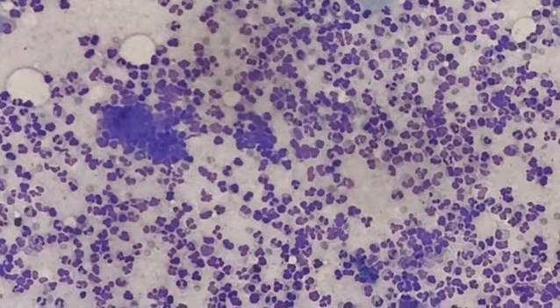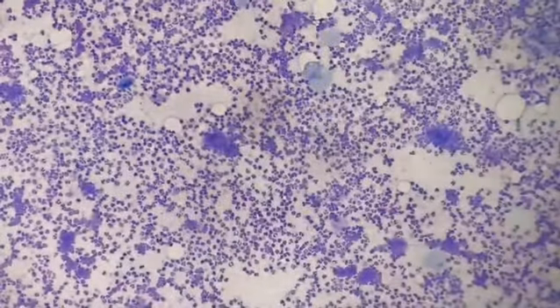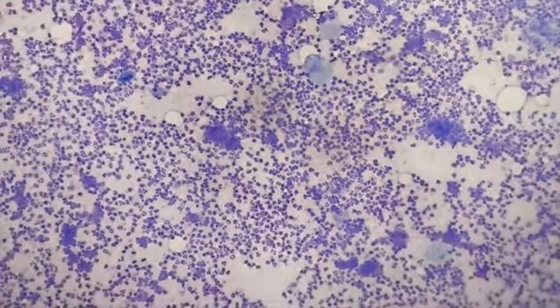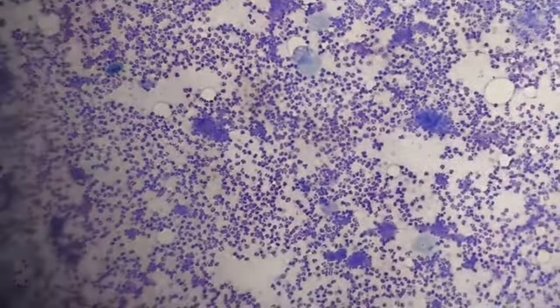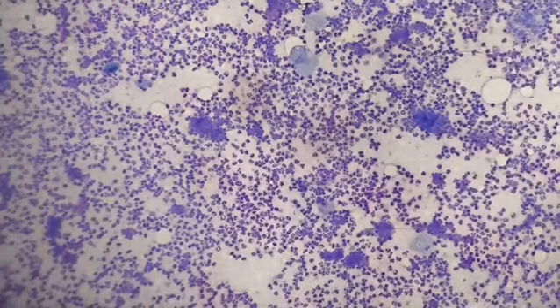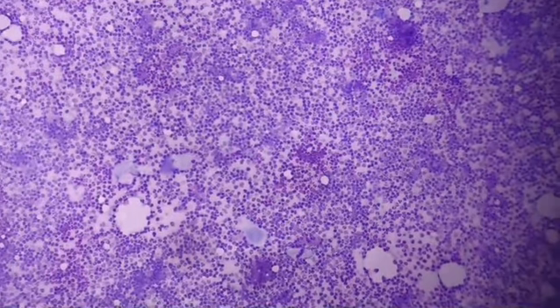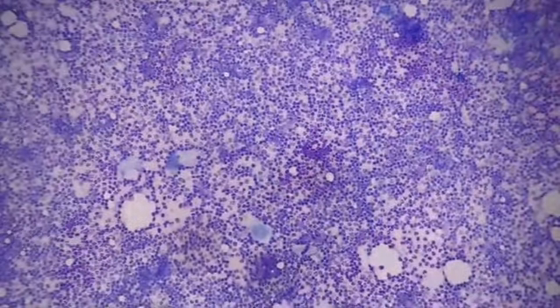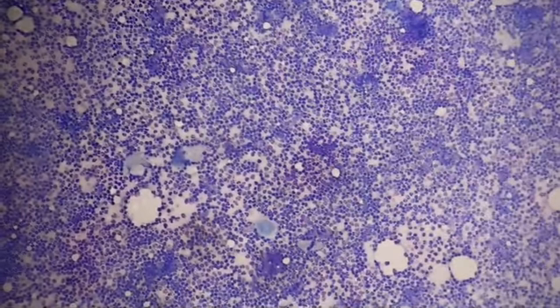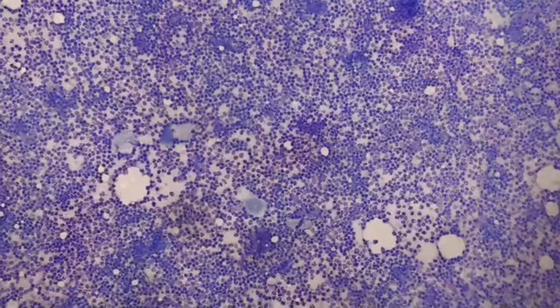Mostly it was composed of neutrophils. In the smear you can see in the top two light blue stained cells, that is your anucleated squames, and similarly it was seen in other areas also. In this image also, what you can see is dense acute and chronic inflammatory cells, predominantly neutrophils, along with scattered lymphocytes, and anucleated squames are also noted. The light bluish areas with the moderate size cells are interspersed in all those areas.